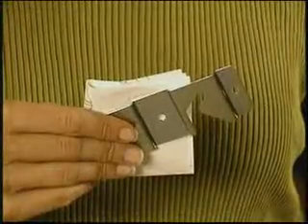Setting up and using your ConMed Hyfrecator 2000 is easy. First, decide where to mount the unit, on the wall or on a portable stand. The wall mounting kit with assembly instructions is contained in your box. You can purchase the ConMed mobile stand separately from your local medical distributor.